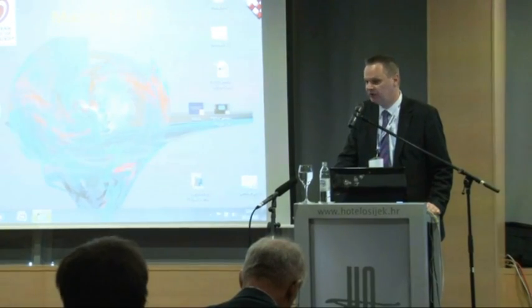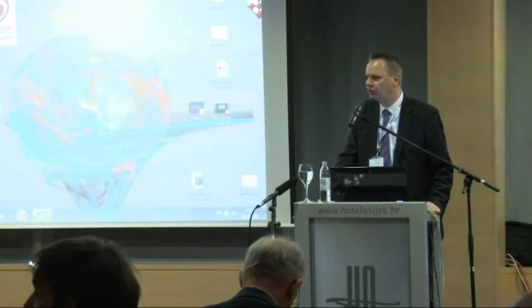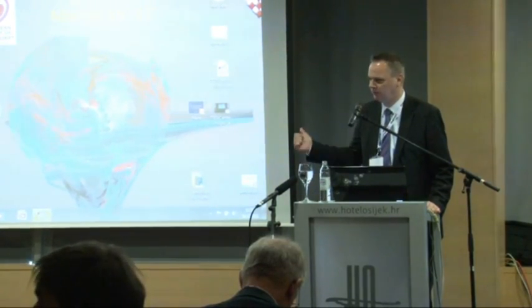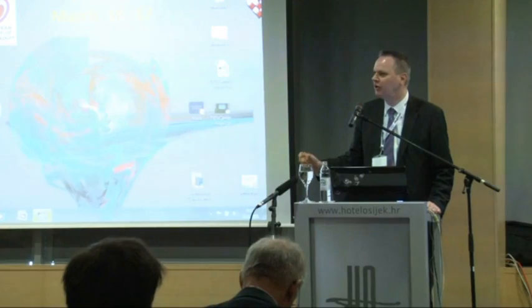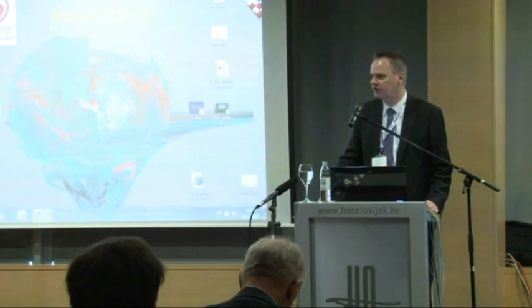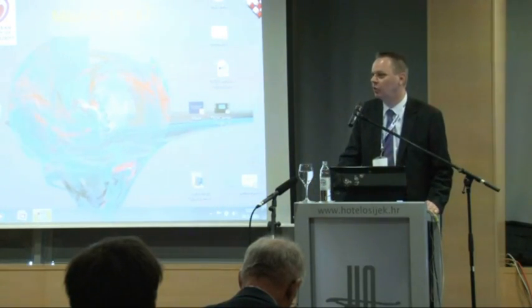Yep. Classification. Are they correlated to the plaque geometry? Yeah, but not all kinds of plaques are included yet. We now had 2 studies, the first in man, and we had the cohort B, which I showed you. Now there is the ABSORB EXTEND study. So it is not only simple de novo lesions which are being stented now, but the population is becoming broader. But for instance, diabetic patients are not in the study yet. And so you start first with the simple ones and then try to expand to the more complicated lesions. But yeah, your point is well taken.